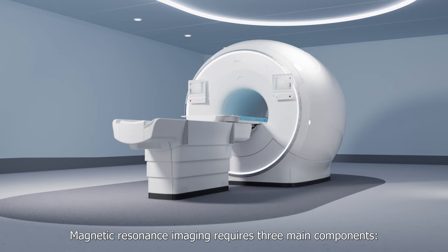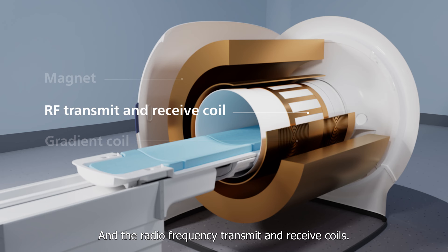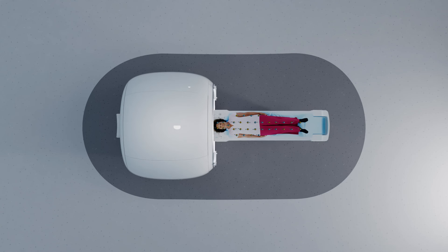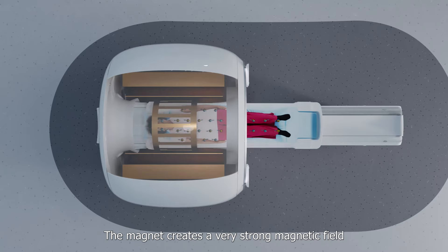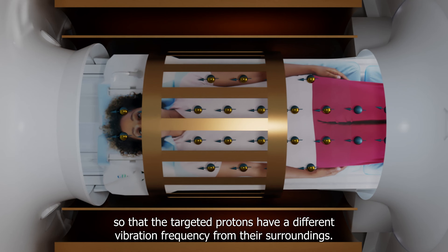Magnetic resonance imaging requires three main components: the magnet, the gradient coils, and the radio frequency transmit and receive coils. The magnet creates a very strong magnetic field that aligns the protons in the body. The gradient coils change the magnetic field in three planes so that the targeted protons have a different vibration frequency from their surroundings.